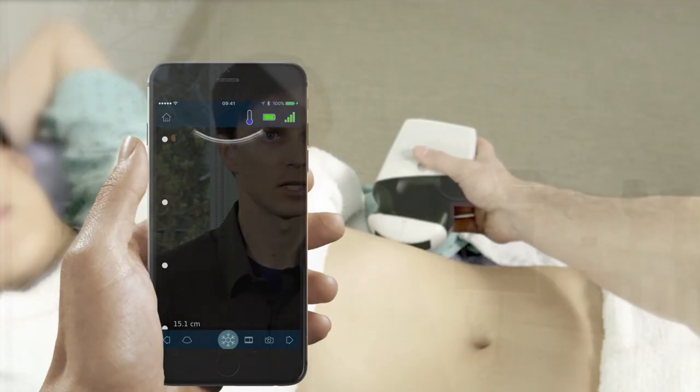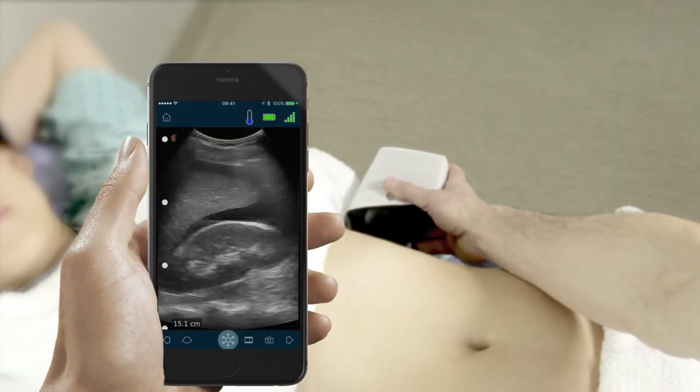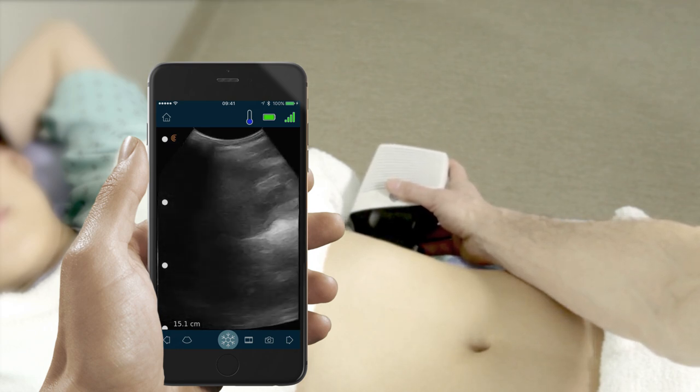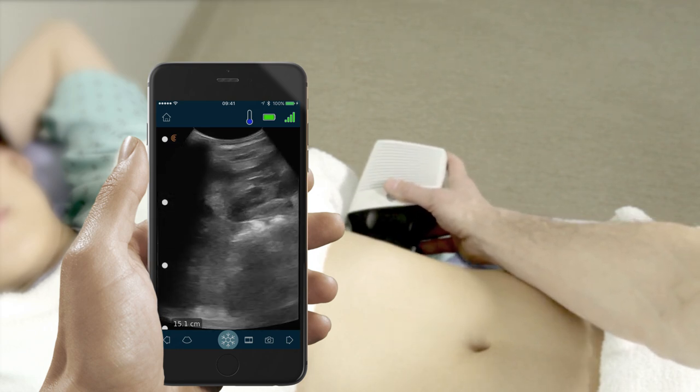This can give us an idea as to whether there are injuries that are clinically occult but could significantly worsen over time. For example, the initially small pneumothorax that could grow into a tension pneumothorax as the patient travels to the hospital. Another example would be a small splenic laceration, which you may pick up on ultrasound as subtle free intraperitoneal fluid. And those patients can become unstable very quickly.